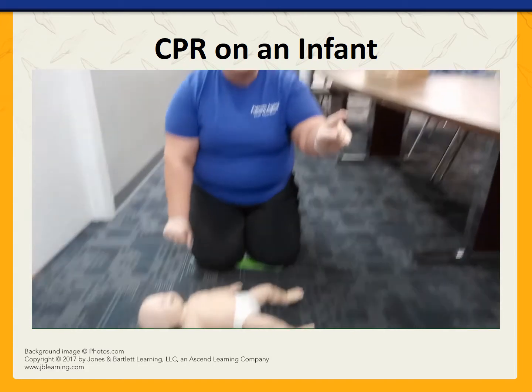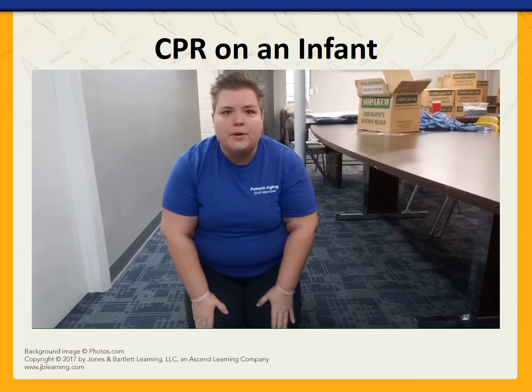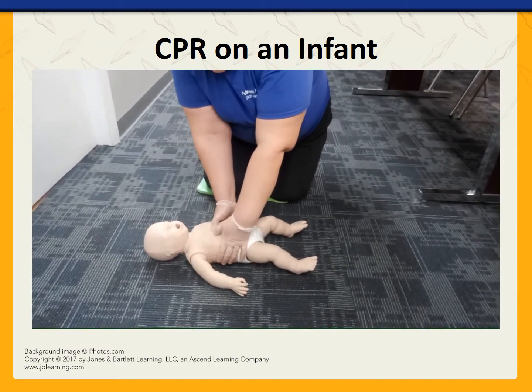Hey, you in the plaid shirt, go call 911. You in the blue shirt, go find an AED. If you can, bring one back to us so we can use it. And then we're going to start into our compressions. With one rescuer, you're going to do 30 compressions.